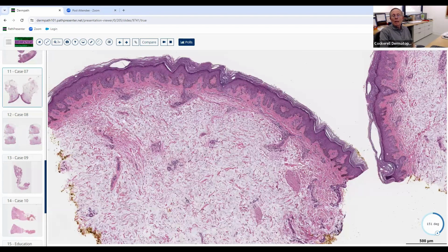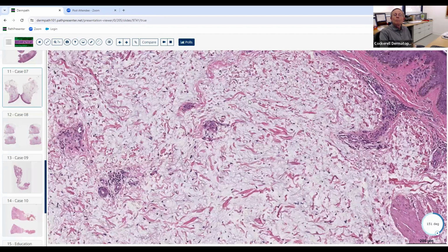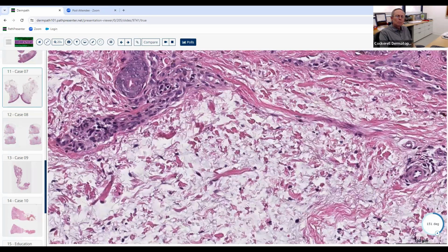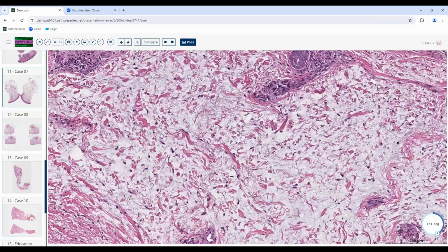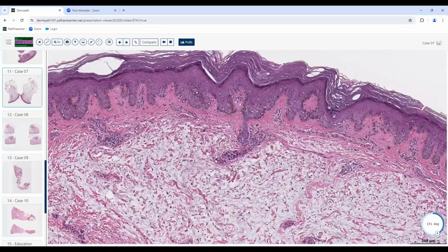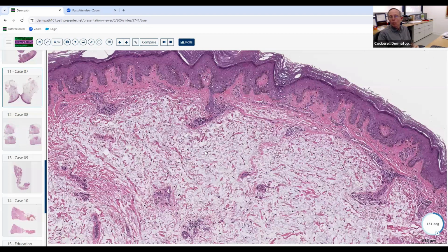Yeah, so there's a little bit of an inflammatory reaction, but it's minimal. And you're right, it is mucin. Very, very good. Anything else it could be besides mucin? I guess you could think of maybe solar elastosis, but it's pretty extensive for that and deeper. Good. You basically reject that. There's actually no fibrils or anything like that. And notice how it's sparing the papillary dermis, which would be kind of funny for that, right? But yeah, that's one thing.